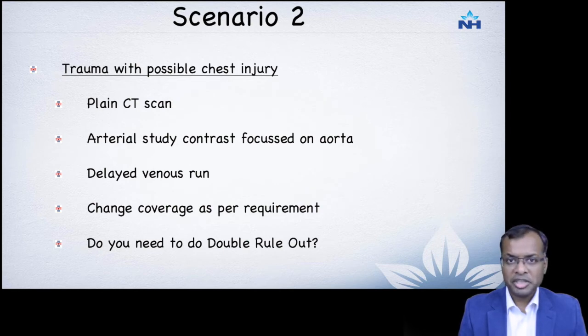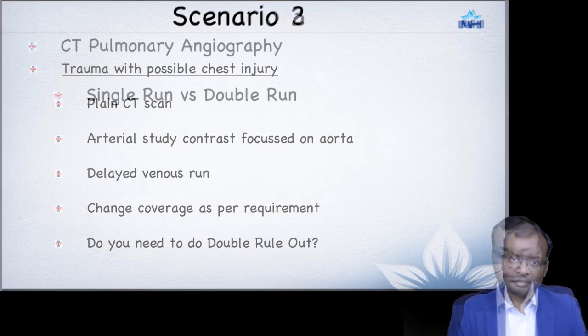The coverage can be changed as per the requirement. If there is a trauma involving the lower abdomen also, you would cover all the way down to the lower abdomen. You want to look at the aorta and make sure that there are no major injuries.